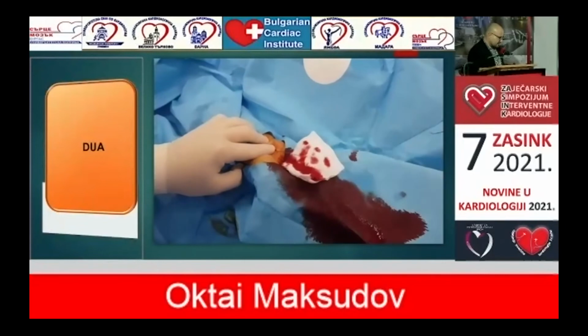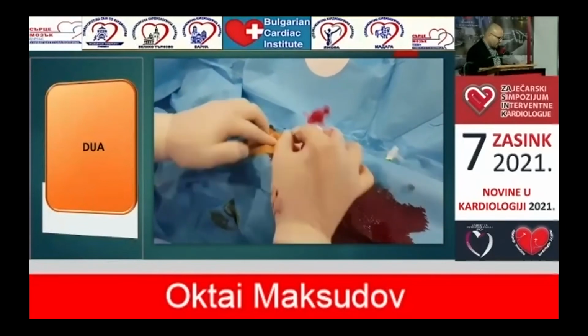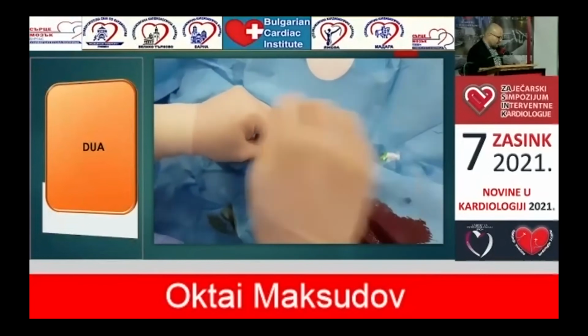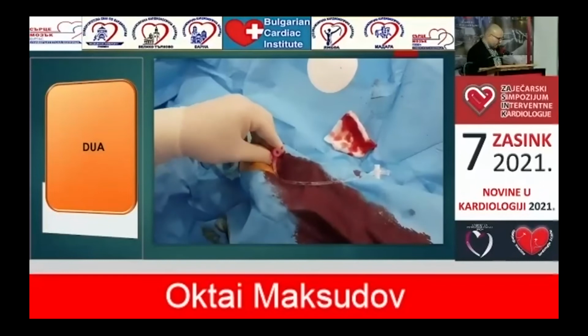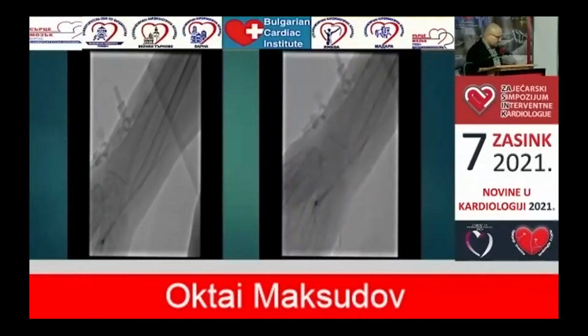And this is the puncturing of the patient. We go first with the 4 French introducer, and after that we change it with a sheathless guiding catheter, 7.5 Asahi. This is the sheathogram as I mentioned.